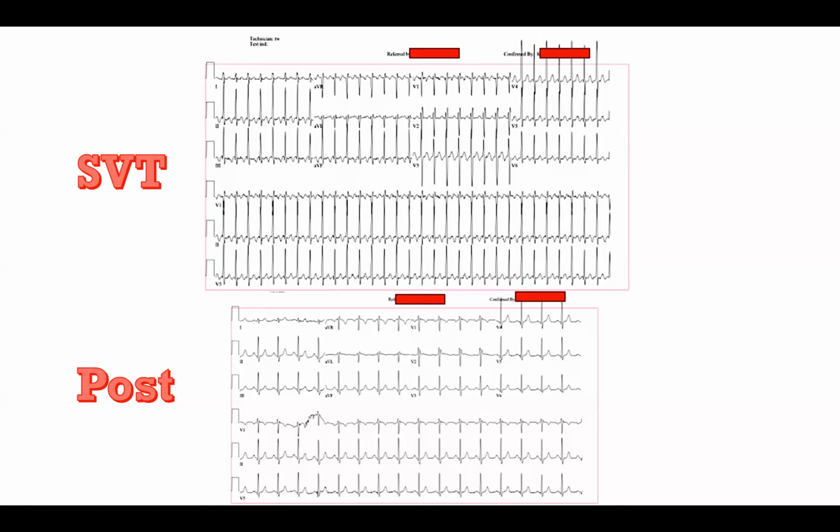Yeah. I think those are both very reasonable assumptions, but they are not rules of thumb. No, let me rephrase that. They are rules of thumb, but they are not definitive. I don't believe a tracing of this type would be on the boards asking that question because I don't think it's clear enough. I think they would probably give a 12 lead ECG tracing in which it was very obvious that there is a P wave, and that would probably be between the QRS and the T wave.